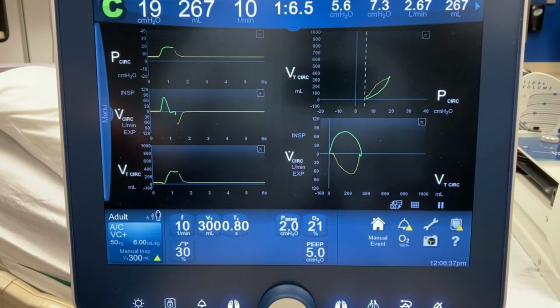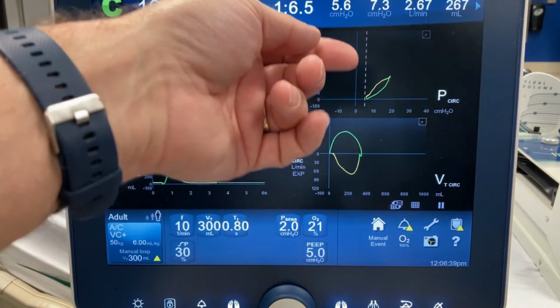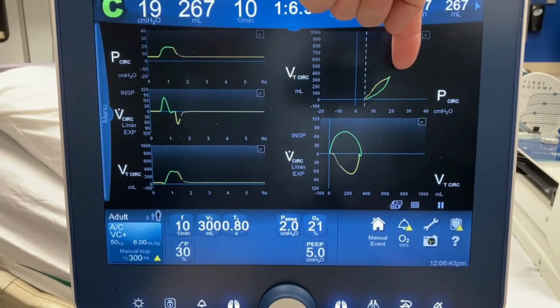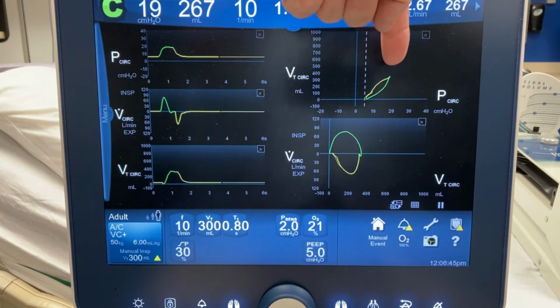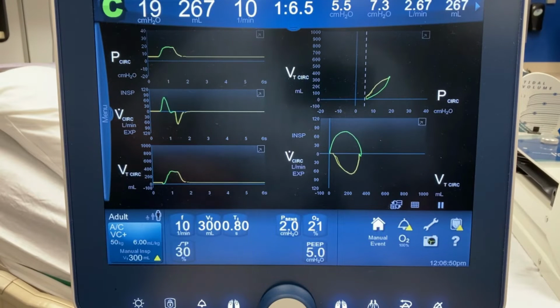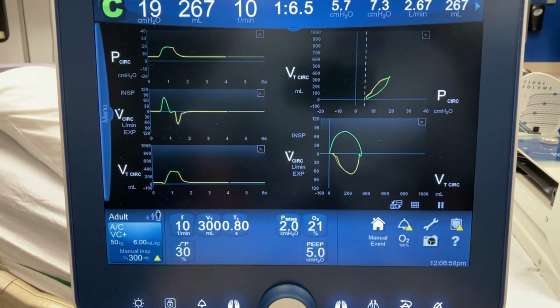And the fix for that is to use a lower volume. So you'll drop your volume by very little, and the pressure will drop by a pretty good amount at that point. So those are the two things I really can't show you. Everything else I'm going to do my best here.